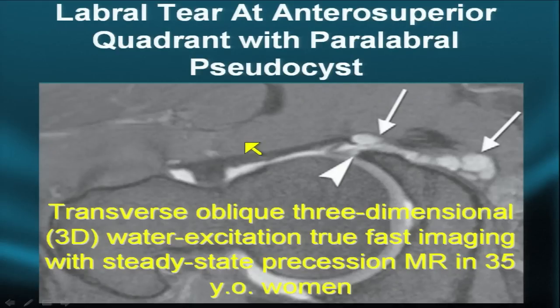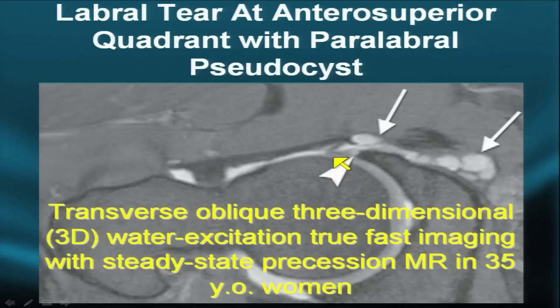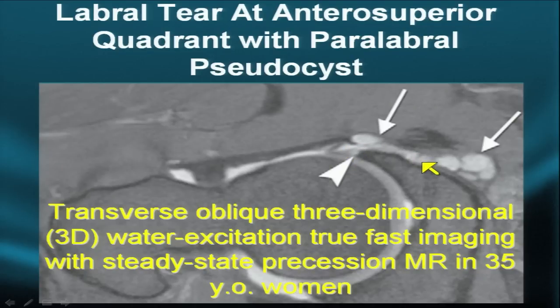In the axial projection we see a labral tear, remembering that at the eight o'clock position anteriorly there is often a small thin but non-full-thickness cleft. A transverse 3D water excitation true fast imaging sequence with steady-state free precession in a 35-year-old woman shows a cyst arising from a full-thickness tear in the anterior labrum — similar to a paralabral meniscal cyst around the knee or shoulder — with dissecting cysts dissecting anteromedially from this through-and-through labral tear.